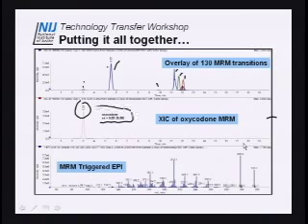So that's my relative retention time for oxycodone against a standard that was run probably a year or more old. That's what's in brackets. So I've got a pretty good qualitative match there for oxycodone. The MRM transition is very specific for oxycodone. Not very much else triggers it. So I could do that, but I want that one extra piece. I want that product ion spectra. And that's what I have at the bottom.